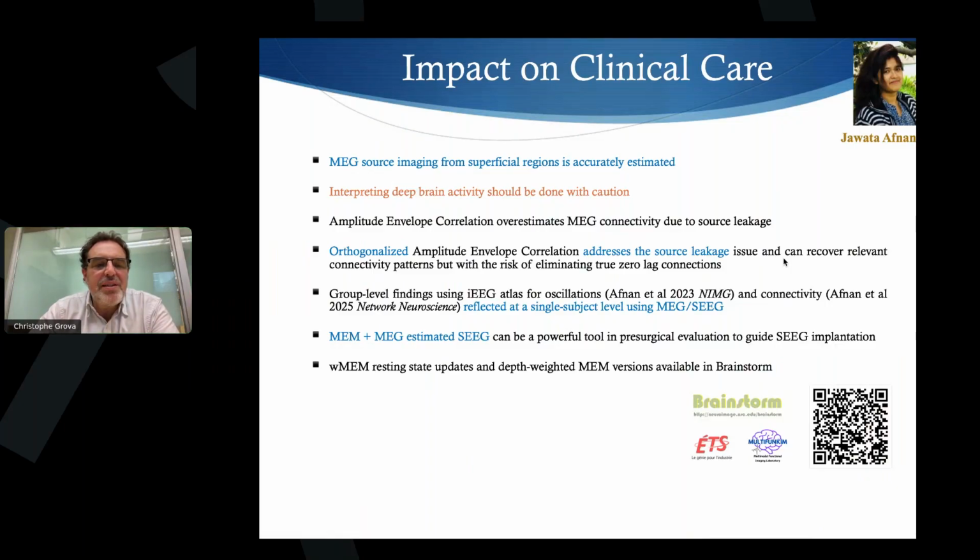But during pure resting state, I think the phase is more local and not such an accurate metric as the amplitude. The two are measuring different mechanisms, and that's also the reason why it's getting a bit confusing, because we have different methods plus different metrics. So we need to see where our hypotheses are in this framework.